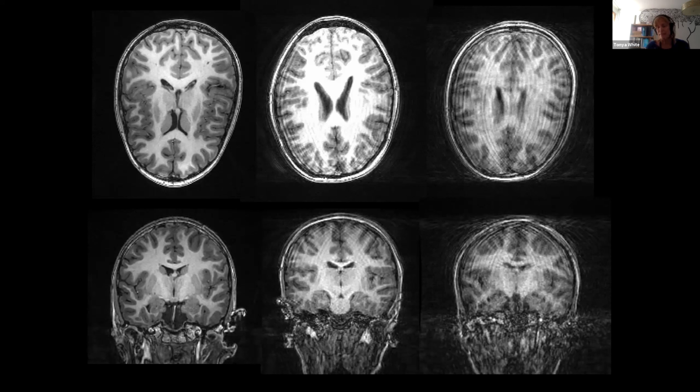We do not do that. But one of the studies with the algorithm that I'm going to show you, they did do that, and that was the GUSTO study. And so I'll show you that data, but we don't, because of the volume of our scans and the lack of manpower or woman power or person power, we don't have the time to unfortunately go and do that. So we tend to exclude. Okay.